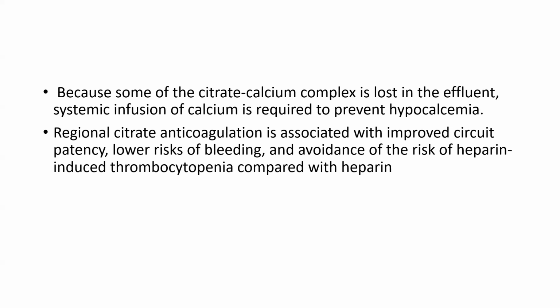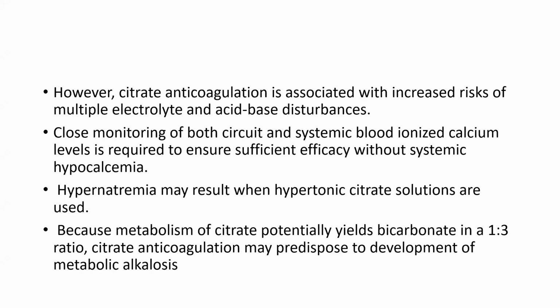Regional citrate anticoagulation is associated with improved circuit patency, lower risk of bleeding, and avoidance of the risk of heparin-induced thrombocytopenia compared with heparin. However, citrate anticoagulation is associated with an increased risk of multiple electrolyte and acid-base disturbances.